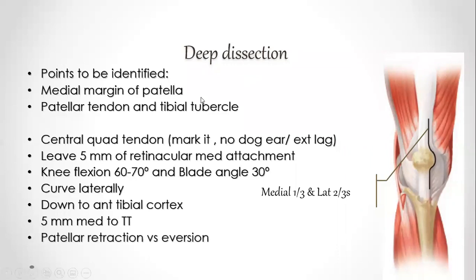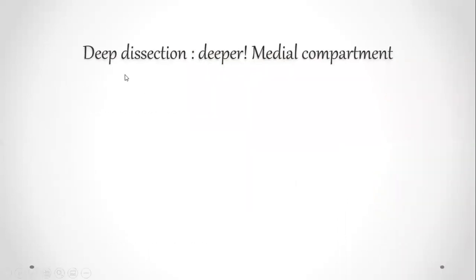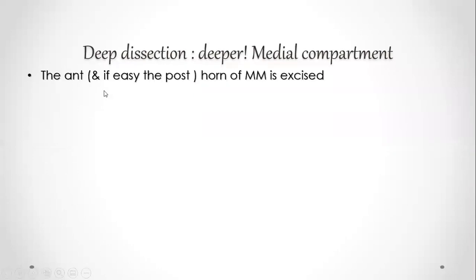Okay, the parapatellar incision has been completed. The patella is either retracted or everted. Some surgeons prefer this, and others prefer that. There is no difference, but much of the literature suggests that in the deep dissection, patellar eversion is better.